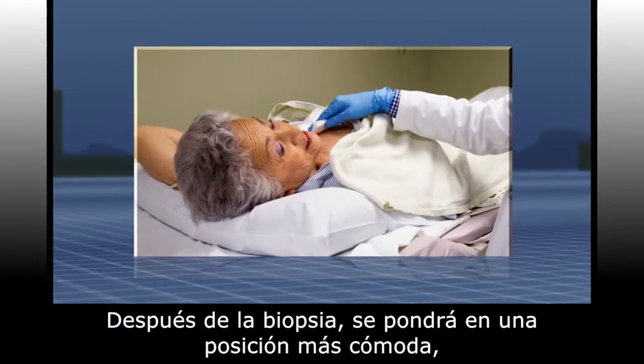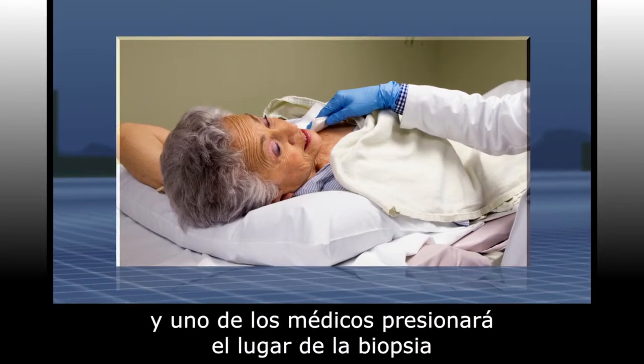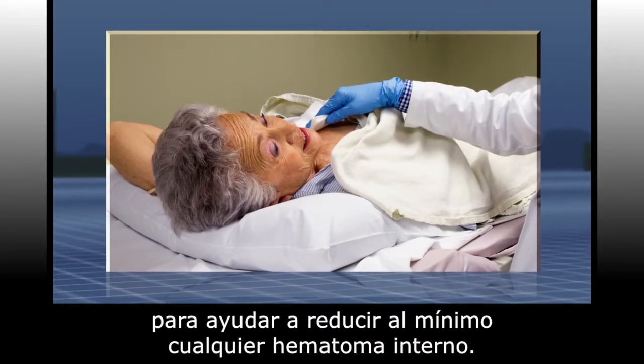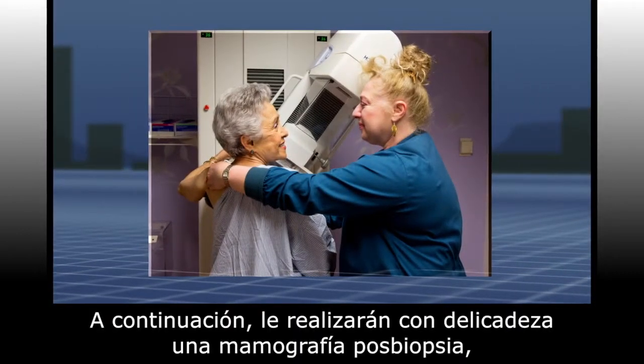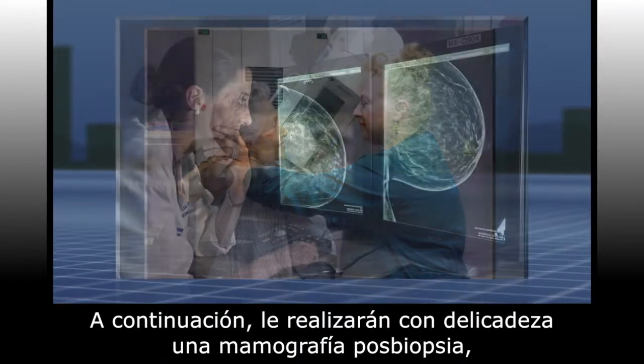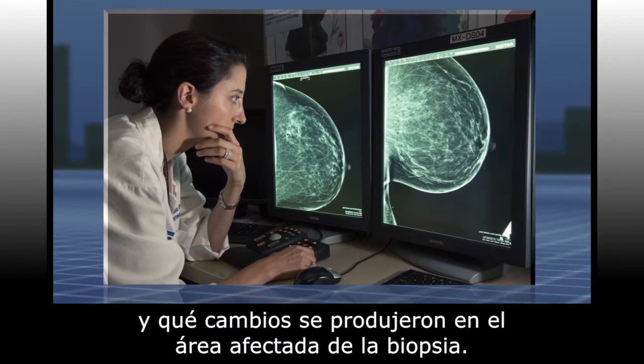After the biopsy, you will be able to move into a more comfortable position and one of the doctors will put pressure on the biopsy site to help minimize internal bruising. Next, you will have a gentle post-biopsy mammogram so the doctors can see the location of the biopsy clip and what changes were made to the biopsy target.